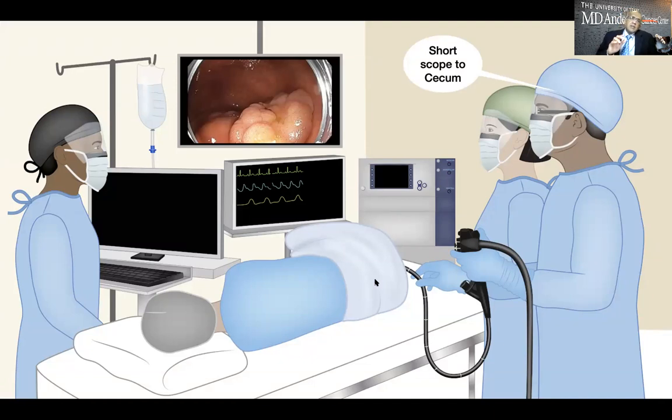And if you're able to reach the cecum in 60 to 70 centimeters, and by gently turning your thumb and rolling the insertion tube, you should be able to move an area. Say, for example, you think about ileocecal valve as your target area. You should be able to rotate your scope and bring the ileocecal valve to 6 o'clock, 9 o'clock, 12 o'clock, and back to 3 o'clock without much difficulty.